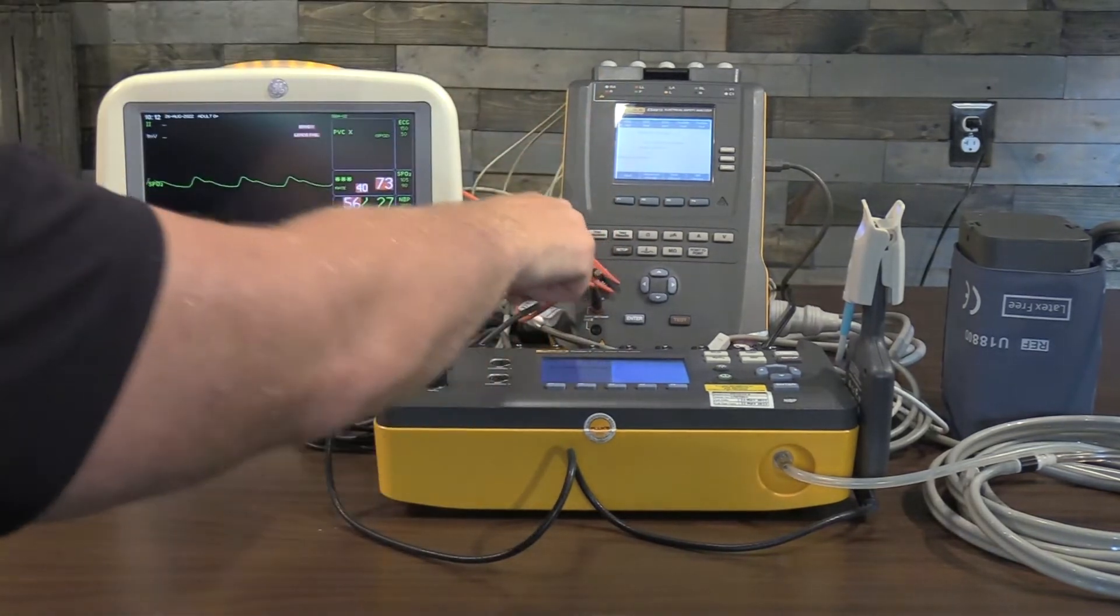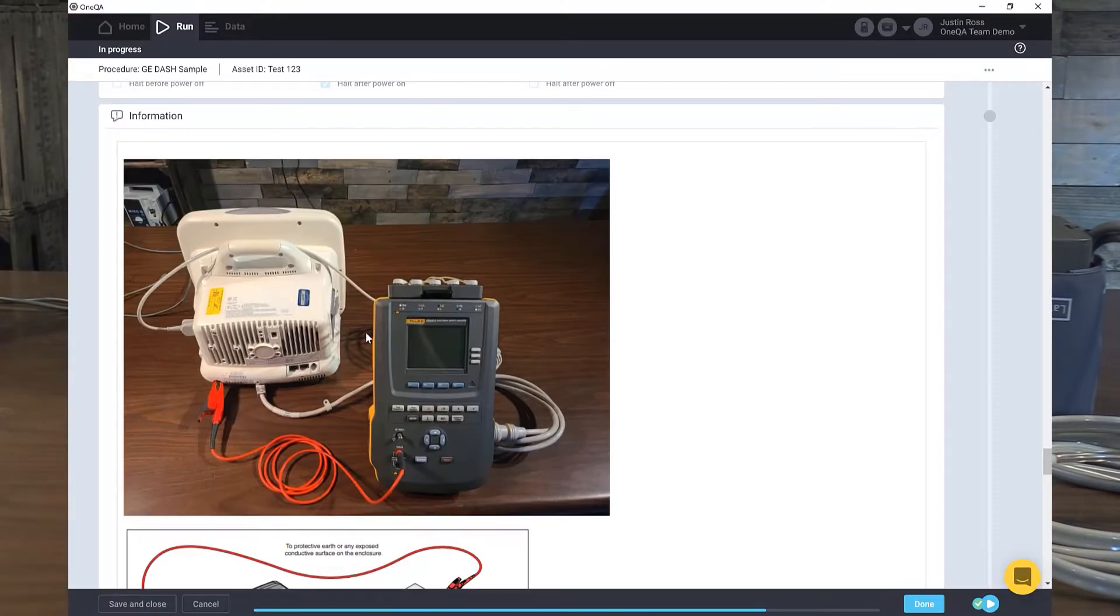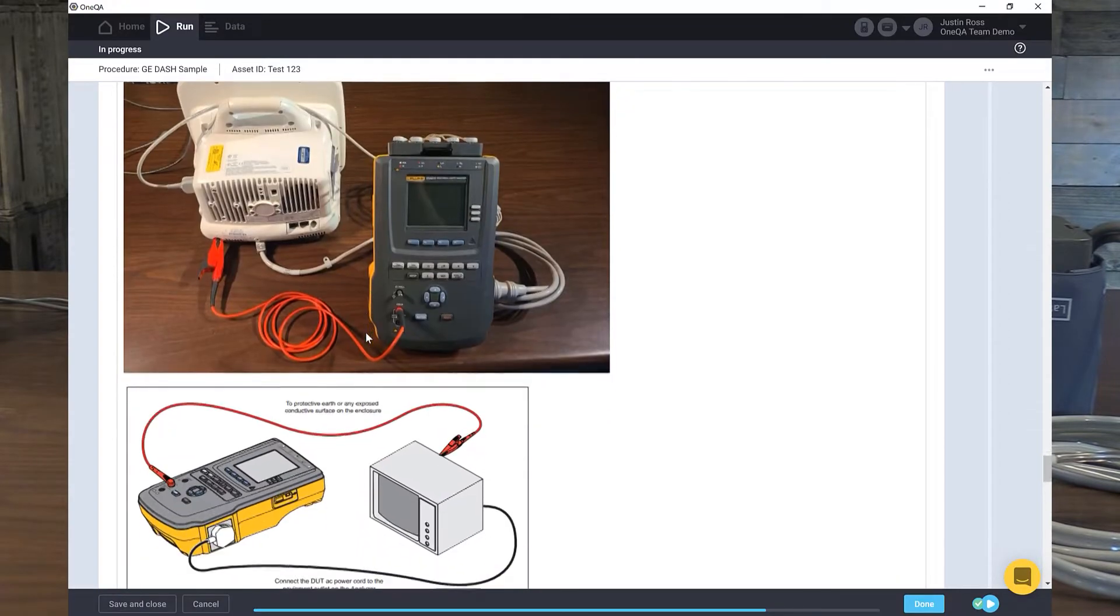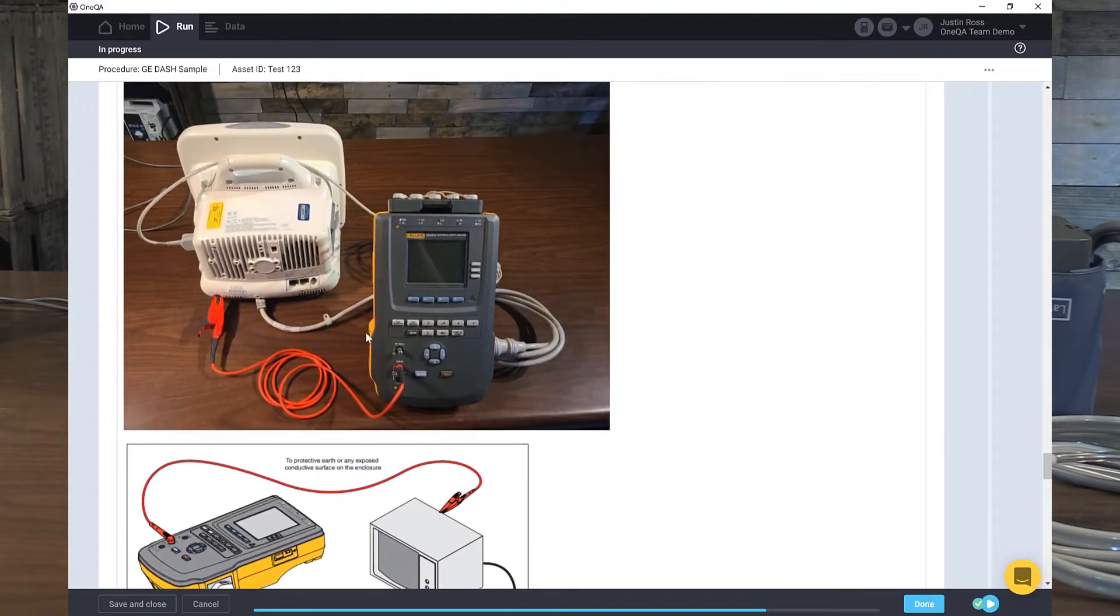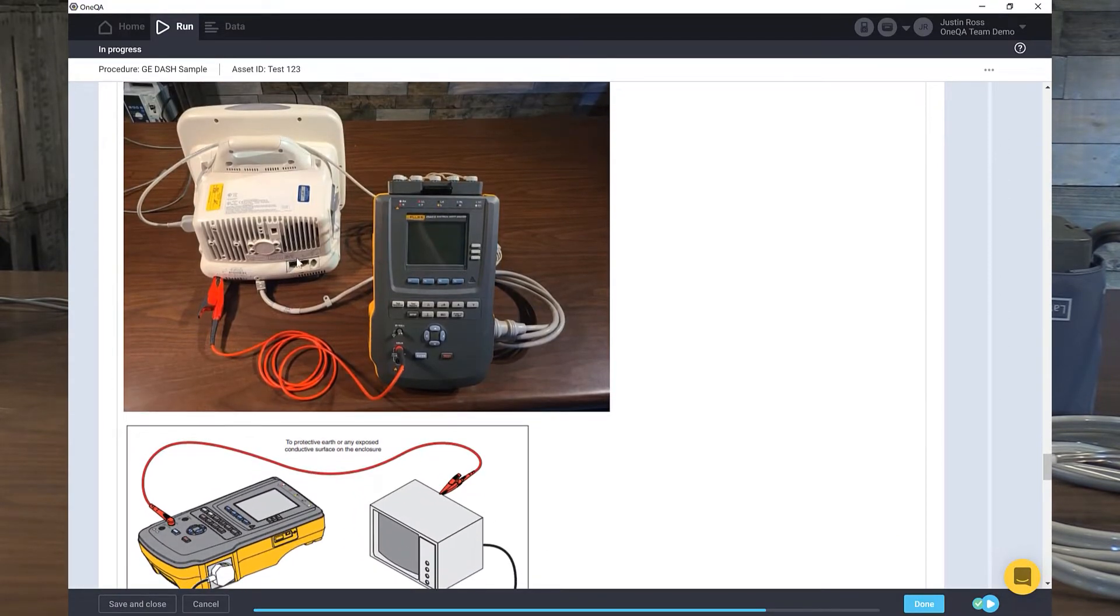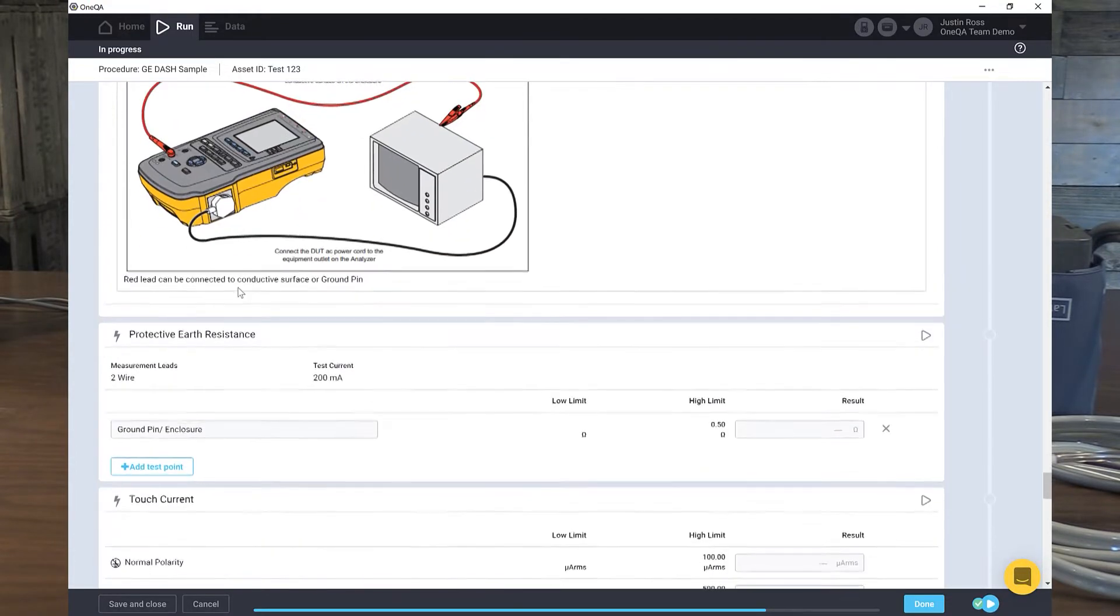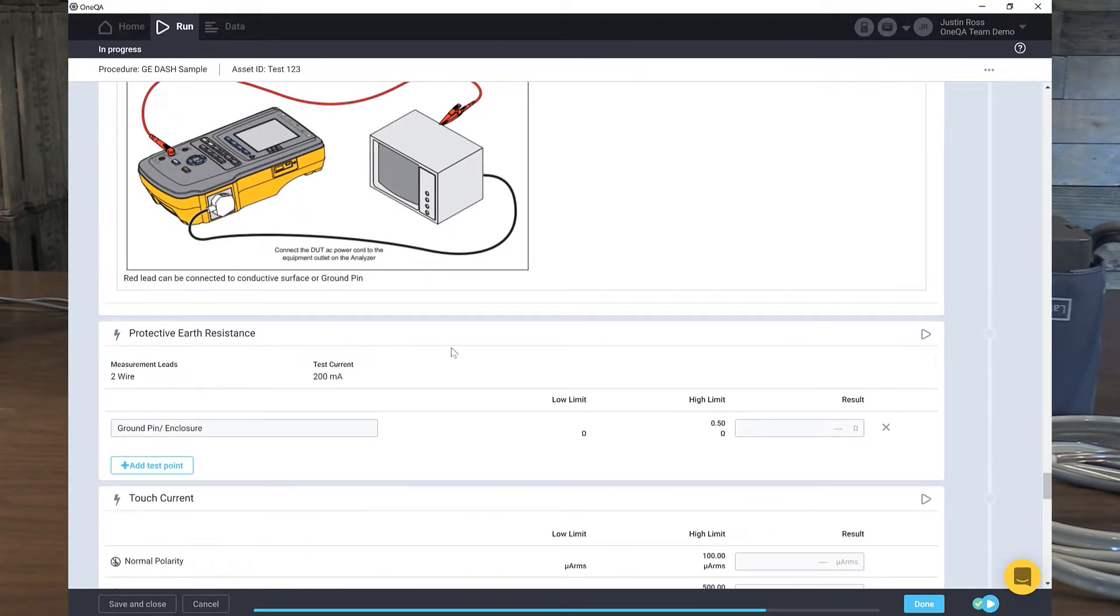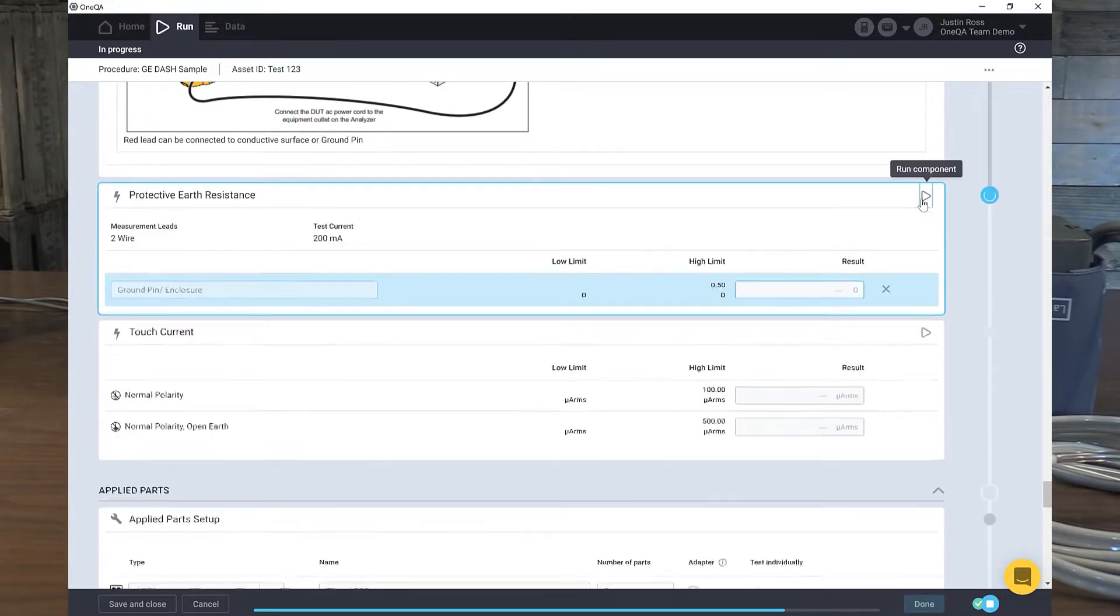Now I'm going to leave this here for a second because I have to zero out my leads. There's my setup, so I know exactly how to set up for my test with my ECG leads. I'm going to take my red alligator clip back to here. But I know from running this a few times, I have to zero out my leads first. Let's move down to electrical safety and push run component here.